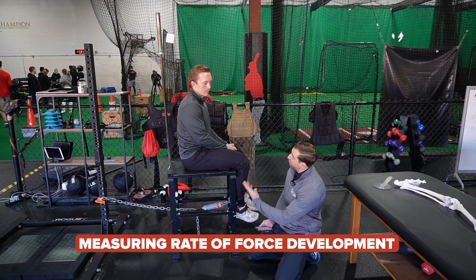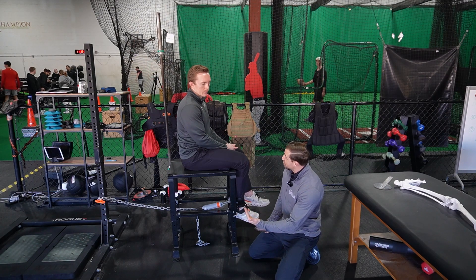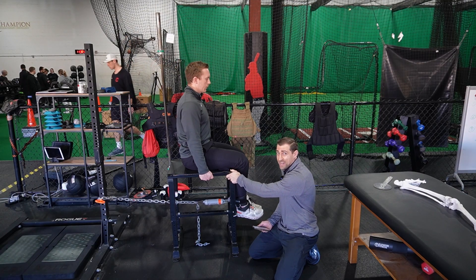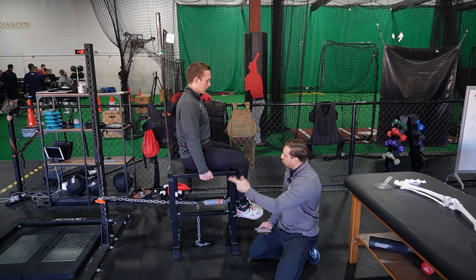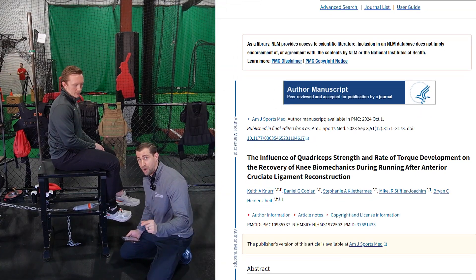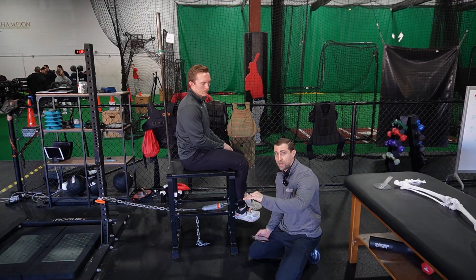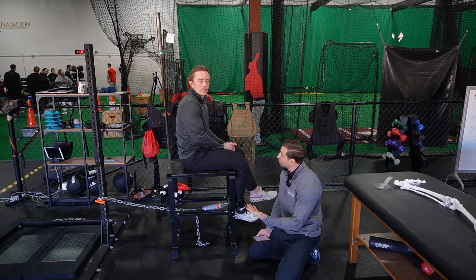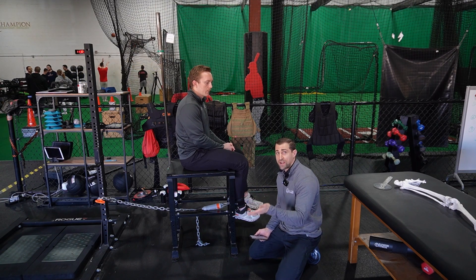For rate of force development, we tell Jacob to take the slack out of the chain, then push as fast and as hard as he possibly can, all at once. Usually I give my athletes a countdown: three, two, one, push — and then relax. We have research to show that rate of force development lags behind peak force. An athlete may have great peak force but can't produce that force quickly, which is a problem when jumping, changing direction, or sprinting. So we're looking for around 90%+ limb symmetry index for both peak force and rate of force development.